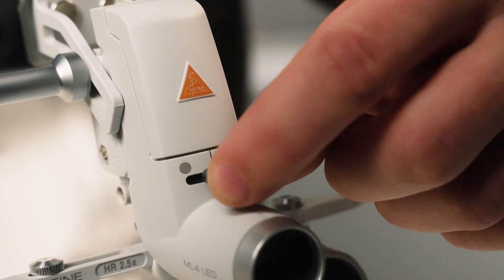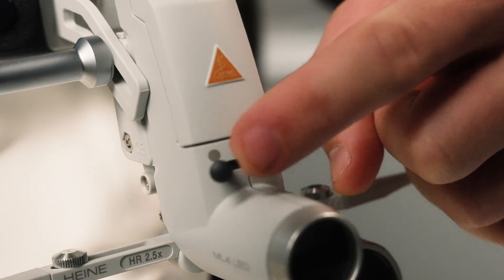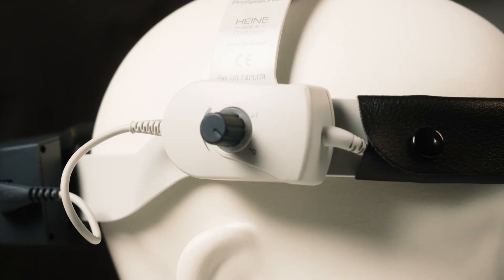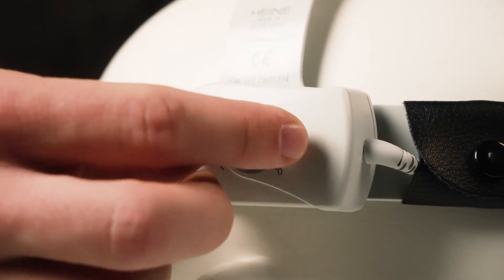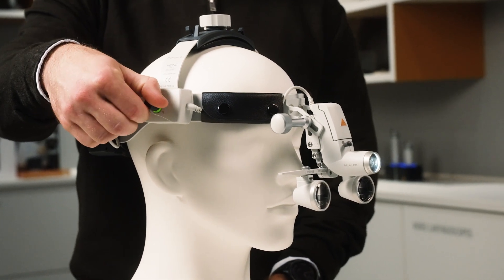Here you can set the size of the light spot from small to its maximum diameter — we set it to the maximum here. With this knob you can switch on the light and make stepless adjustments of the brightness. Just remember the position of this knob; we're going to switch it on later.